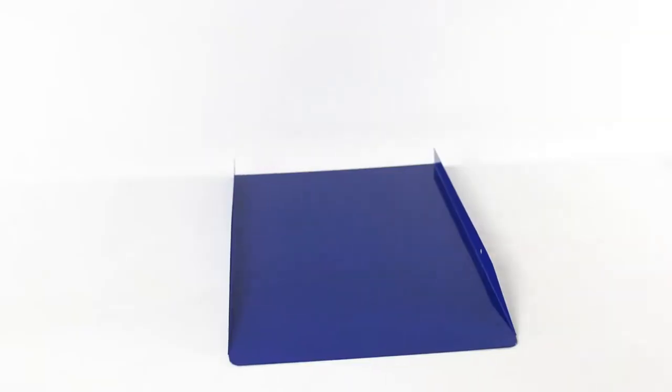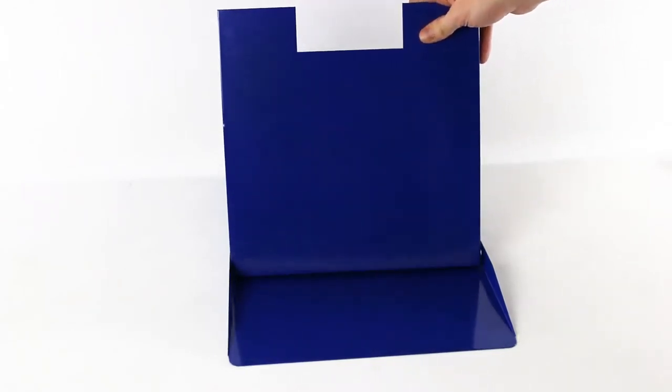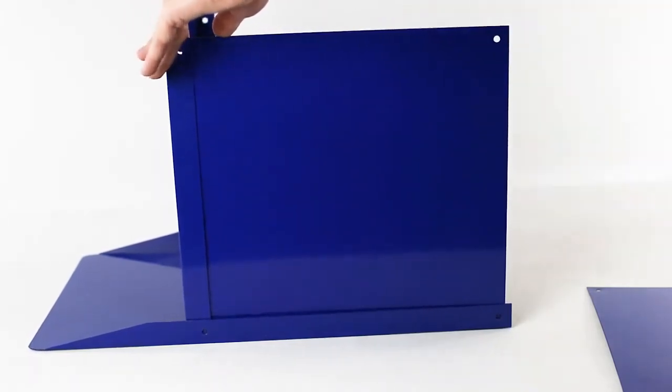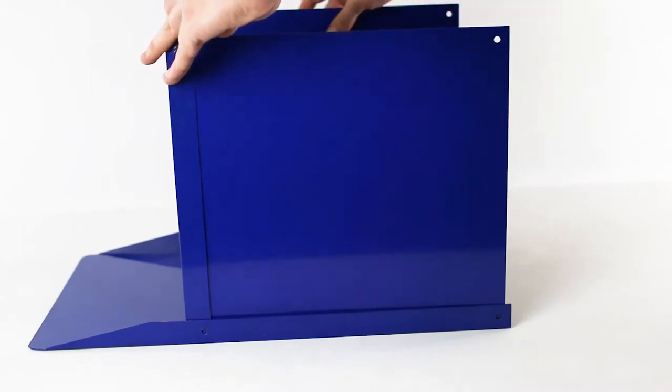Begin with the bottom plate on the floor. Line the foot plate holes with the holes on the front of the bottom plate with the groove side up. Line both side plates with the holes on the bottom plate. The side plates should be positioned inside the lips of the front plate, top plate, and bottom plate.